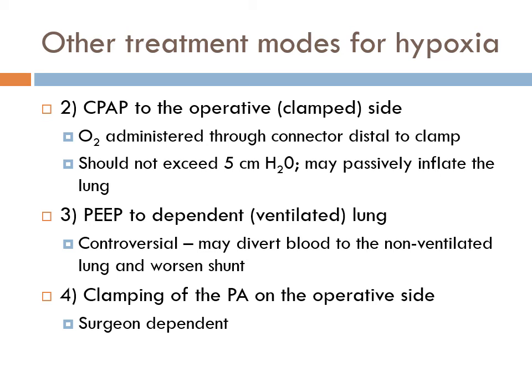So one of the things you can do is on the double lumen tube, you can, I don't have one, I was actually going to take one from work yesterday. Mapleson circuits, we've all had those in the anesthesia class, right? You can stick a Mapleson circuit on. So what I would do is pop this off. Both cuffs are up. All I care about is that I'm ventilating the left side. But my operative side is not helping us when it comes to ventilation. It's still getting a percentage of cardiac output. Despite you helping us, we're still going to have shunting.